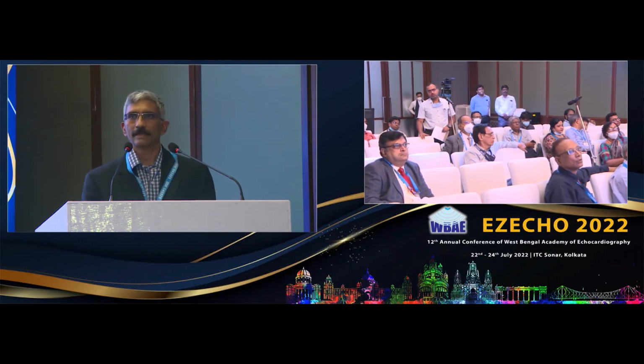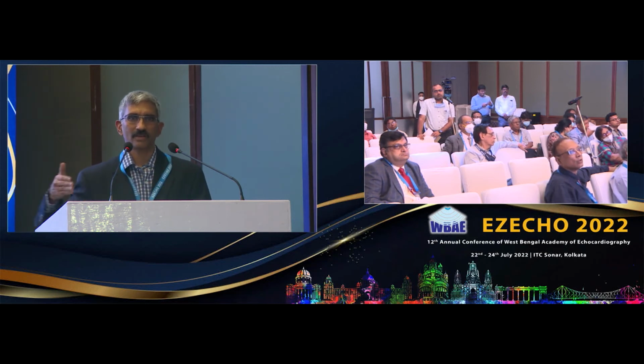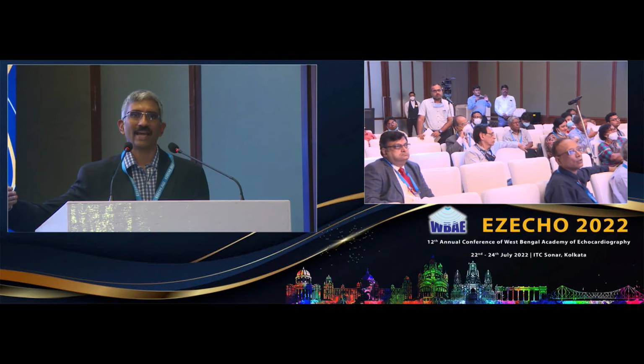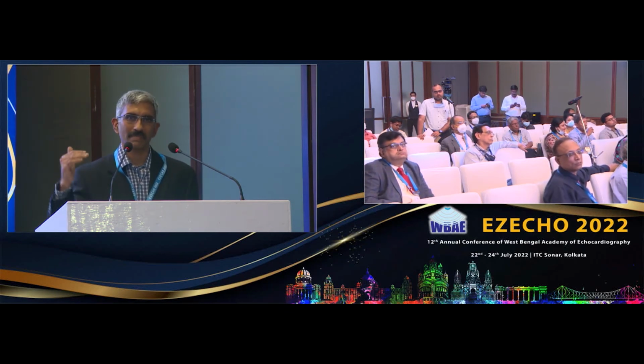Sure. For the first question, the main role of cardiac MR is that it has the ability to find the ejection fraction, and to compare ejection fractions across time is very accurate, because it's an observer independent type of study. If I showed you an image, you can draw the regions of interest, everybody else can draw, and so the inter and intra observer variability on cardiac MR is much less than in other sequences and other exams, which is one of the reasons why it's the gold standard for ejection fraction analysis.